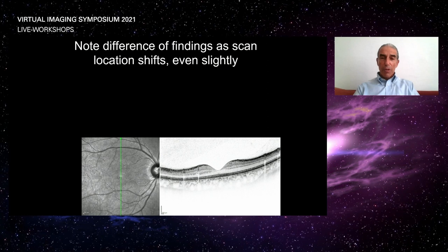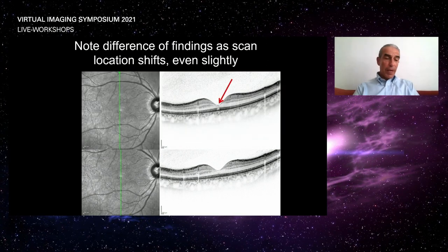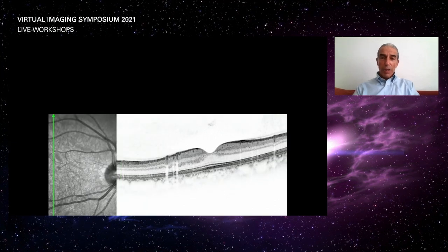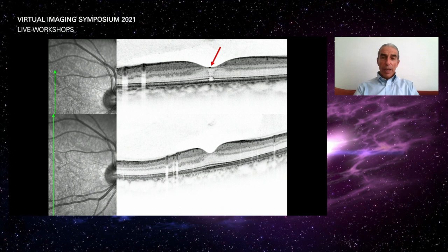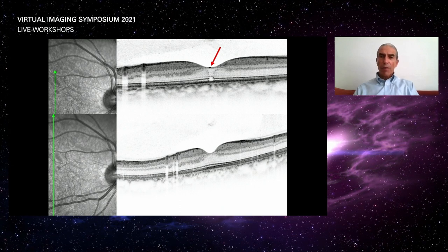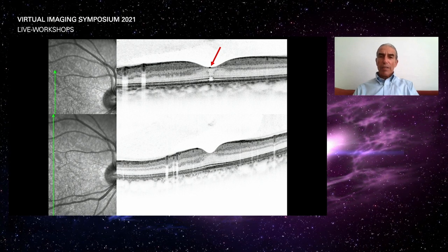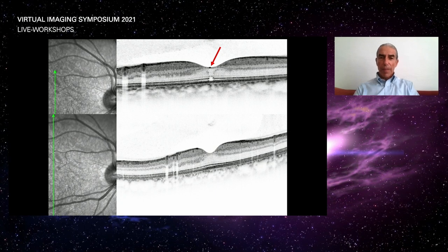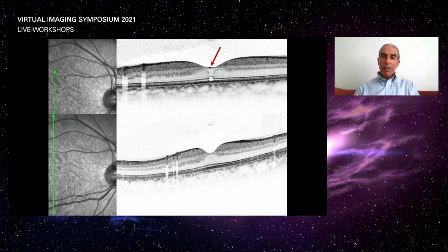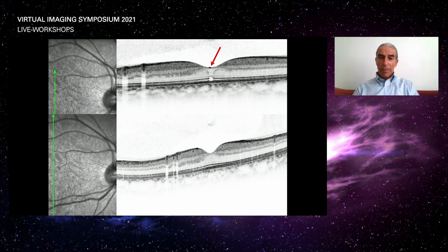And a couple of examples. One scan looks foveal, the second scan is even better foveal. And if we magnify that, we'll see that this looks like a normal scan, but this one shows us a subfoveal absent area in the outer retinal layers. And the trick is to find that small hyperreflective artifact in the center of the fovea. It is sometimes not visible if there are multiple opacities, but in most patients it's possible to see.